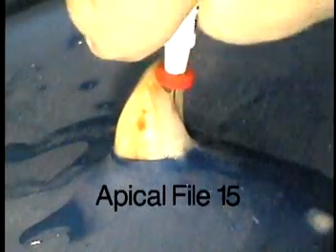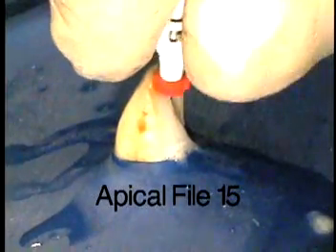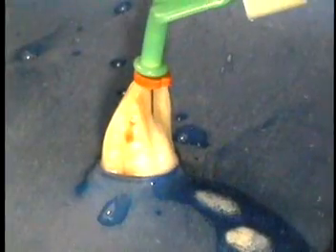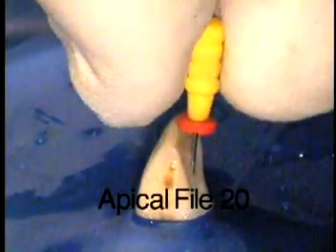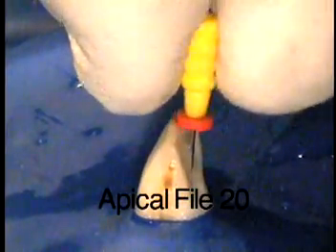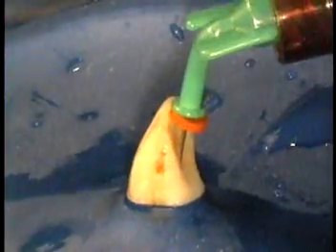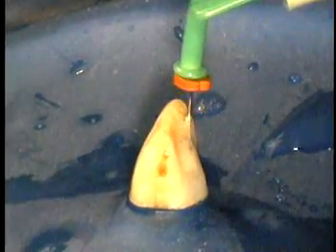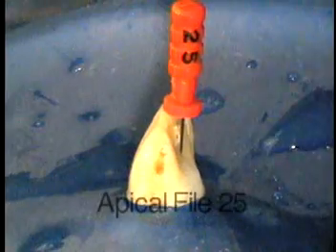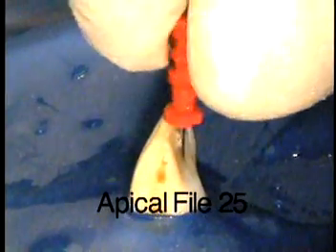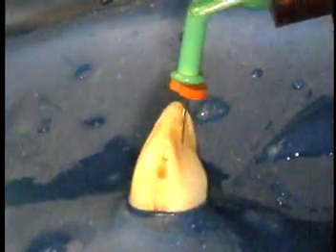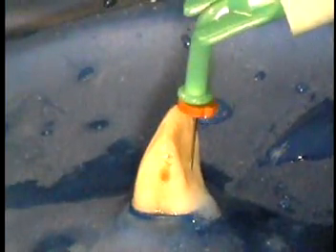These files are used in a conventional twist-pull or watch-winding motion. Sizes 25 on up have a slightly greater than ISO taper, so that when used with an ISO gutta-percha point for a single cone technique, tug-back is achieved at the tip.